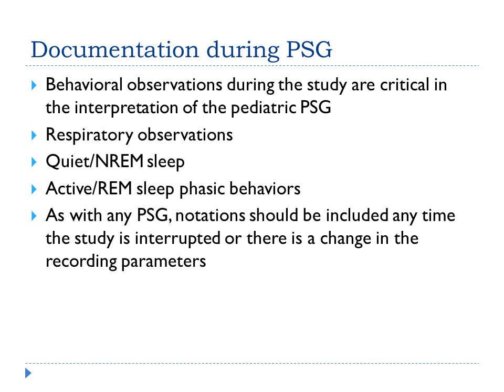And as with any PSG, notation should be included anytime the study is interrupted or there's a change in the recording parameters, maybe if there's some artifact, if you go in and fix it, or maybe there's some artifact and you choose not to fix it. Make sure you're documenting what you're doing and why you're doing it. Let's go on to our next slide.